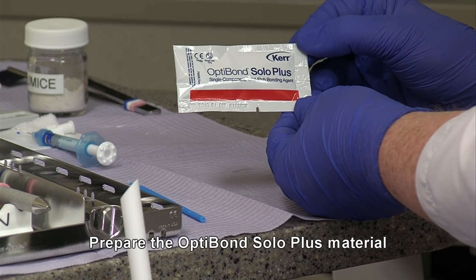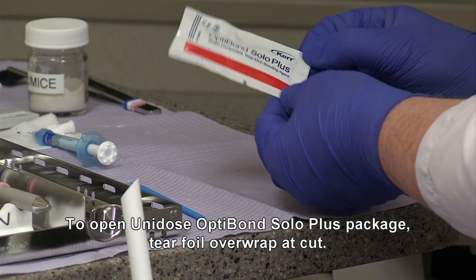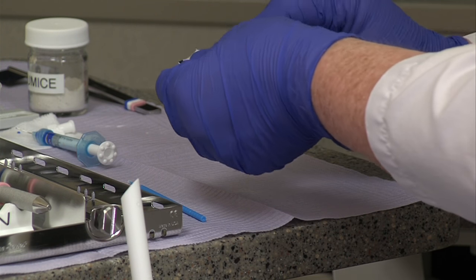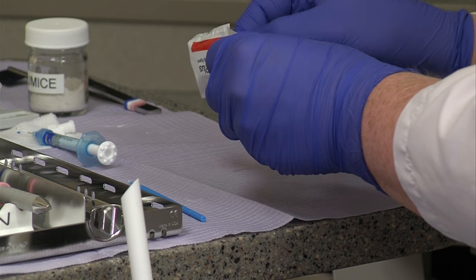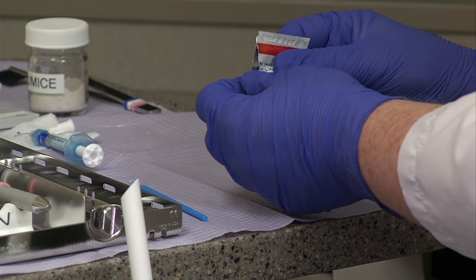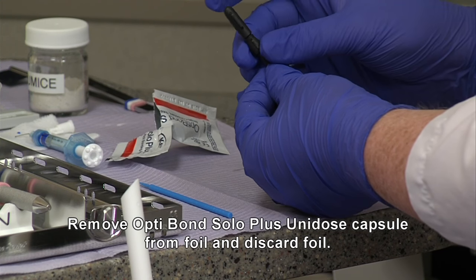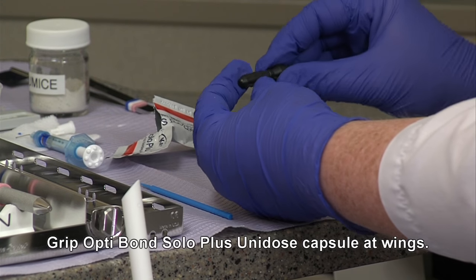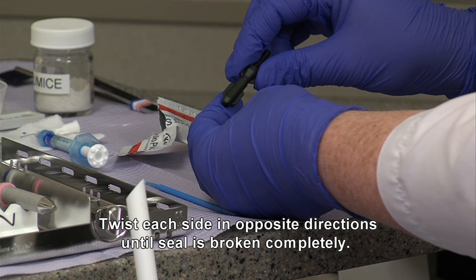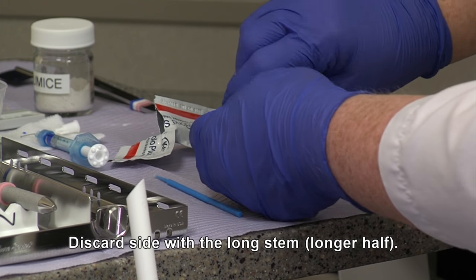Prepare the OptiBond Solo Plus material. To open the Unidose OptiBond Solo Plus package, tear the foil overwrap at the cut. Remove the OptiBond Solo Plus Unidose capsule from the foil and discard the foil. Grip the OptiBond Solo Plus Unidose capsule at the wings. Twist each side in opposite directions until the seal is broken completely. Discard the side with the long stem, the longer half.